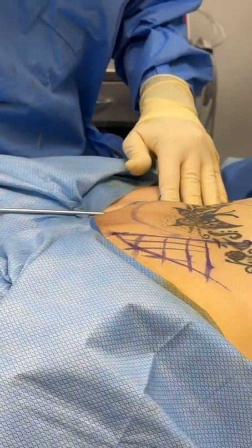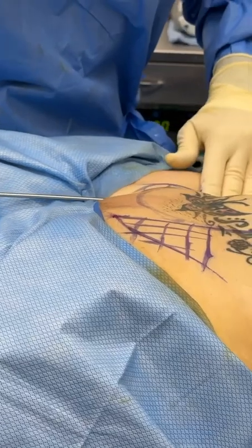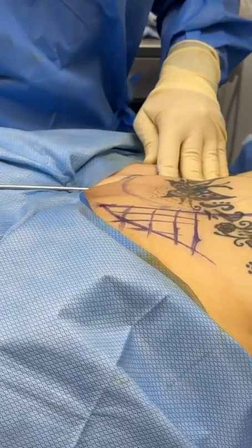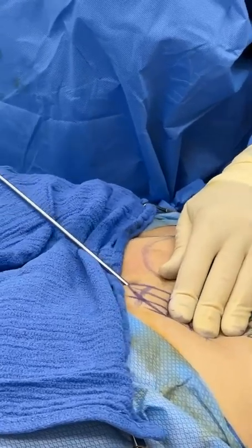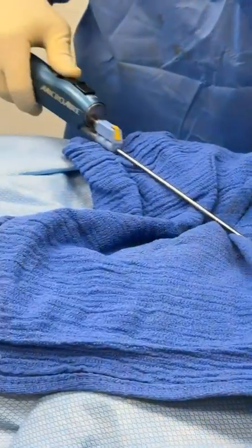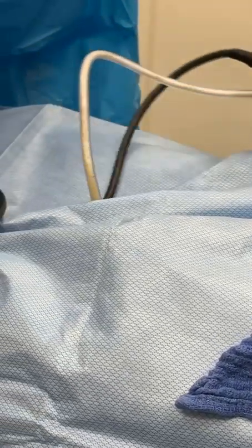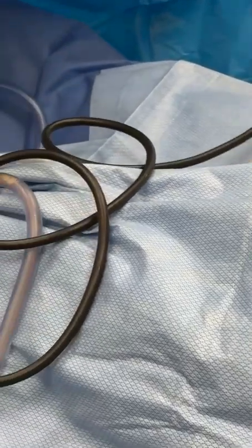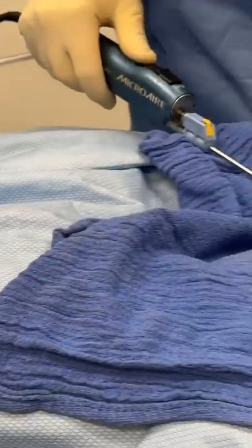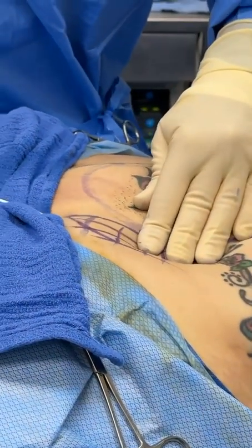But another advantage besides the safety is that you're gonna get this output. Wow. And so when you do this, look how my strokes are so slow, and look at the output, right? But if I'm moving my arm very, very fast, then there is gonna be bleeding. It's the speed.